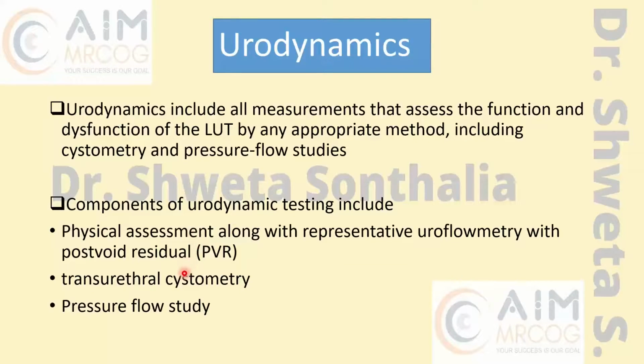So what are the components? There will be a physical assessment with uroflowmetry. First will be the uroflowmetry, which is a non-invasive test. The woman will simply come and pass urine on the uroflowmeter and you do the uroflowmetry. Very important to do uroflowmetry and to do the post-void residual.